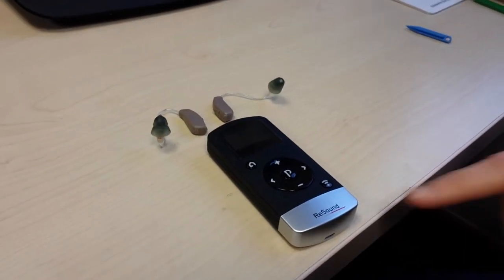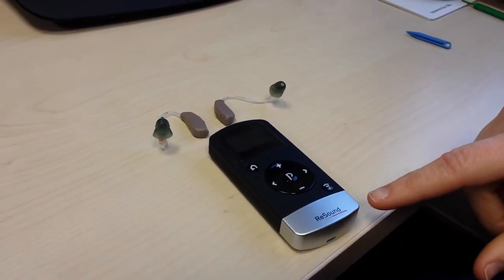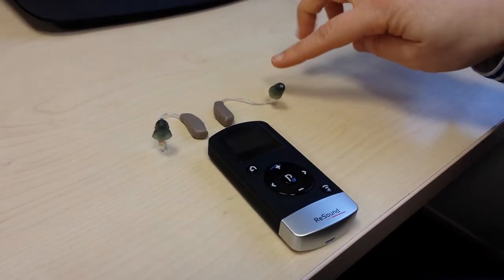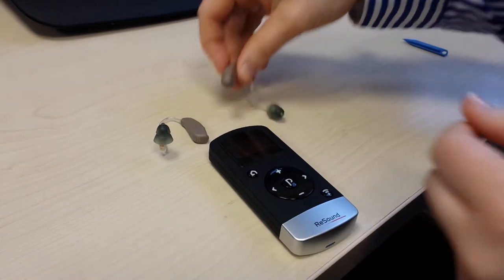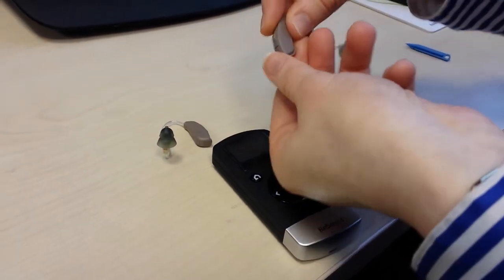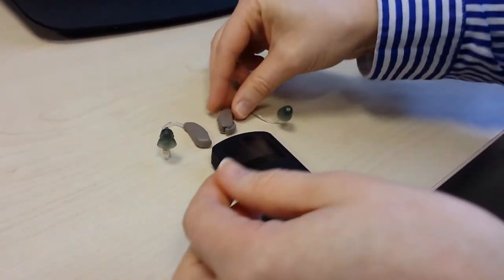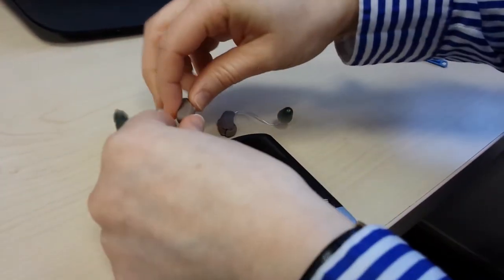To pair a ReSound remote control to the hearing instruments, first of all, open the battery doors on both hearing instruments.